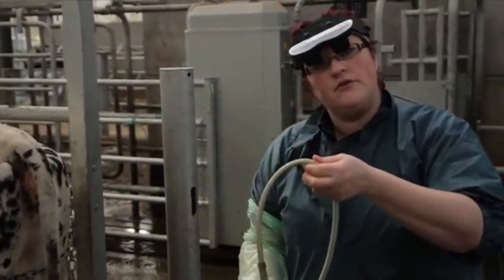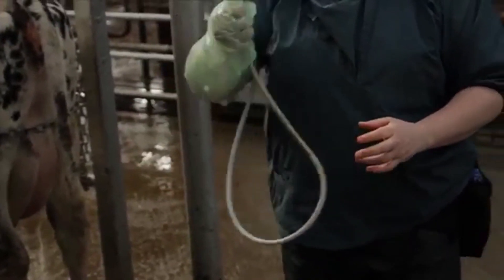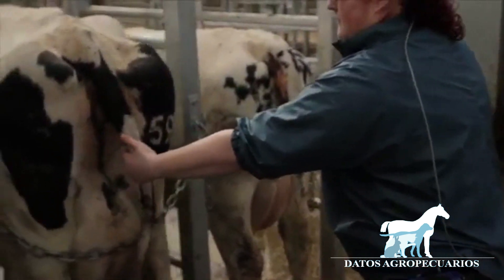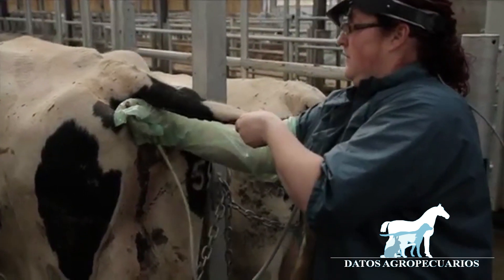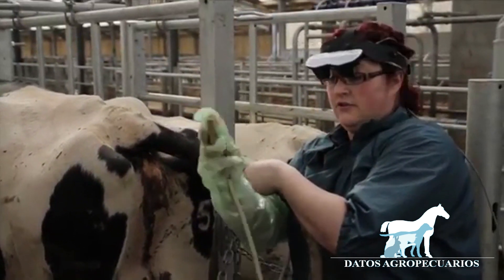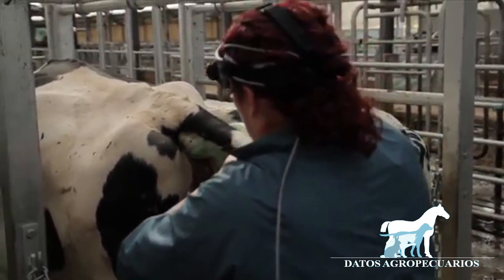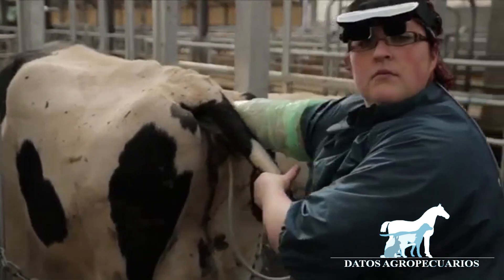You'll notice that I keep the ultrasound probe — the head of it — away from any potential hazards at all times. We'll now grasp the probe again, get some more lube, and lubricate the surface of the probe. Coming to our next cow, we use the back of our hand, grasp the probe with a leading edge, hold it in the palm of our hand, use our thumb as a backstop, and go into the cow.